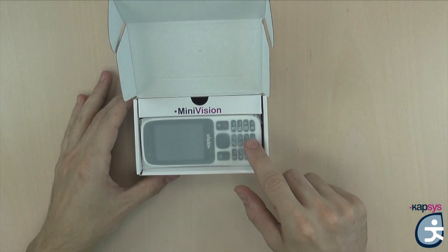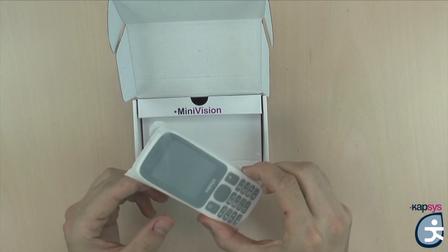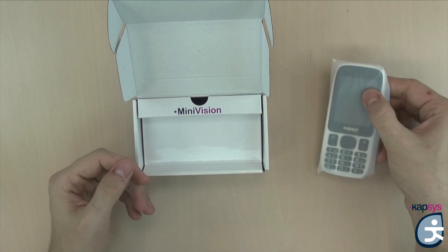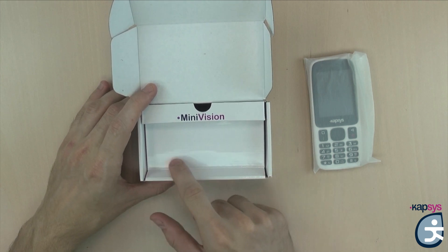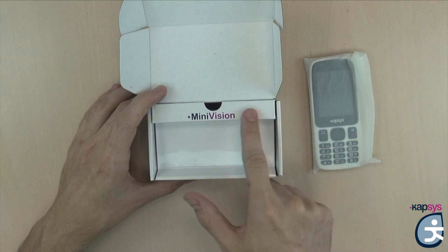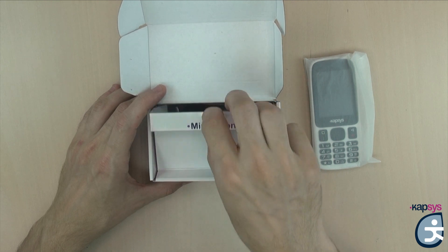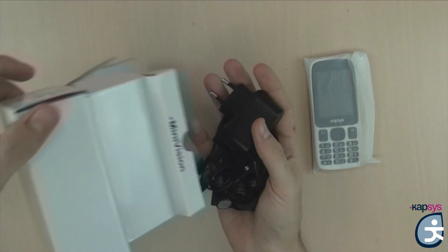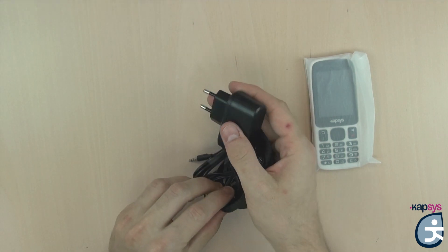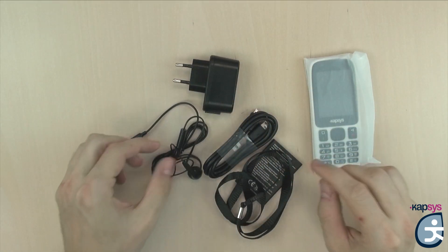Below is the Minivision, which is packaged in a small pouch. Below the phone is the accessories compartment. To access it, simply lift the phone cardboard housing — there is a small hole above the box that allows you to lift it. In this compartment you will have five elements, which we have removed from the original pouches for the purpose of the video.